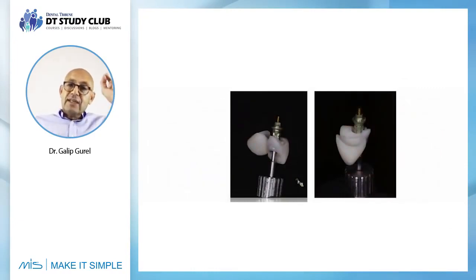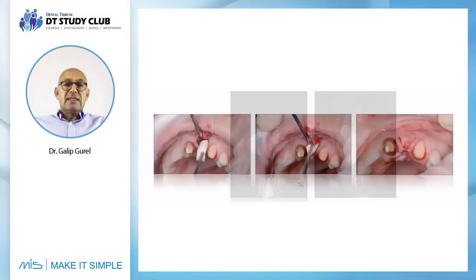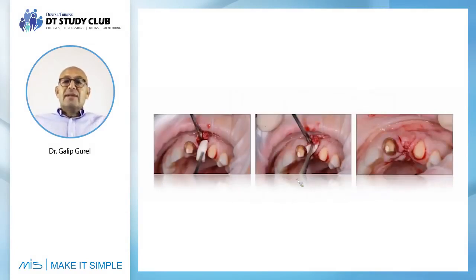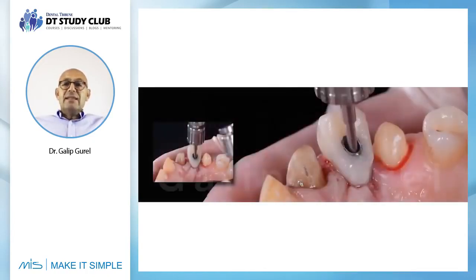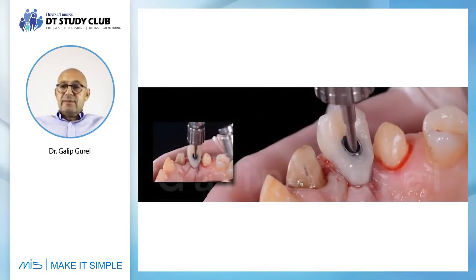And the beauty here is that I let the connect take care of this part, which I didn't need to worry about, and I will only deal with the 1 millimeter coronal part, this part, to give the final shape so that the gingival margin of my provisional will set the tone for the final aesthetic design. So meanwhile, Junaid is placing the soft tissue into the area, and this is the abutment that I immediately screw in.